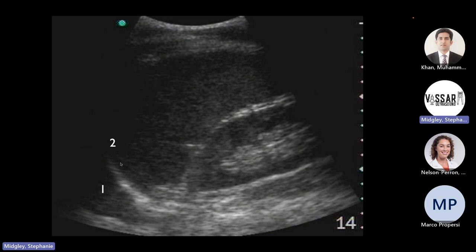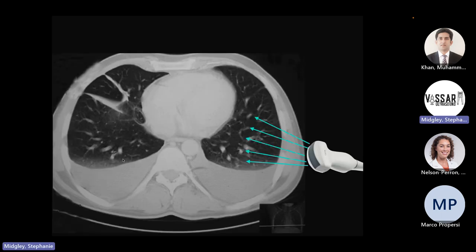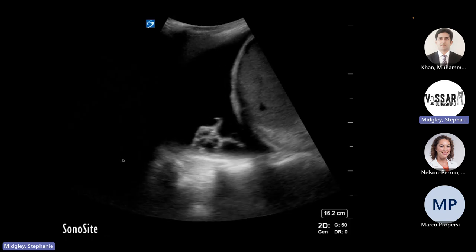Know on this side, the first place free fluid is going to develop on the left is actually at the dome or the top of the spleen, and it's going to track along between the spleen and the diaphragm. So this one's a little bit of a different spot where it develops. Again, between spleen and kidney, inferior tip of the spleen, inferior tip of the kidney. Pleural effusions, same thing. Find your spine, make sure you aim posterior enough.